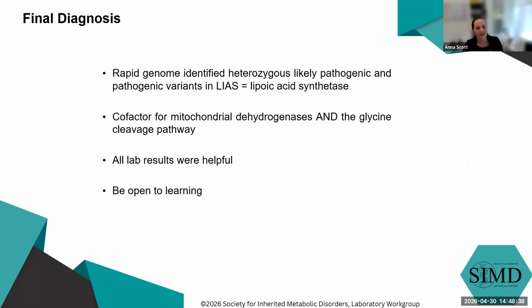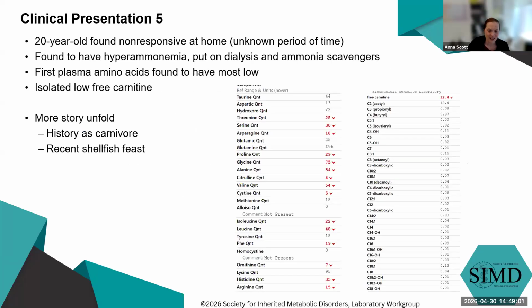And I wanted to highlight this case as a way of saying we are learning stuff all the time. No one reference has every pattern of metabolites that you might see in every genetic defect. Our patients don't read the textbooks of what their profiles should look like, and they can throw us for a loop. I'm always learning from organics. So last classic clinical presentation, I think. Oh, no, not classic presentation, but I wanted to highlight this as another one where being open to learning.